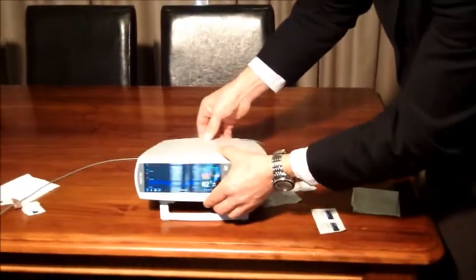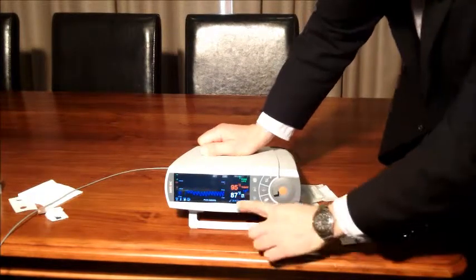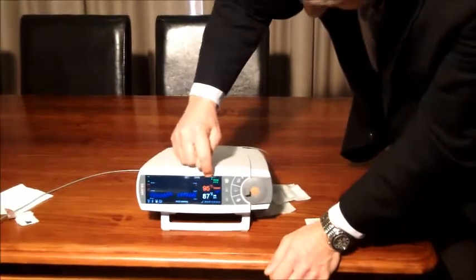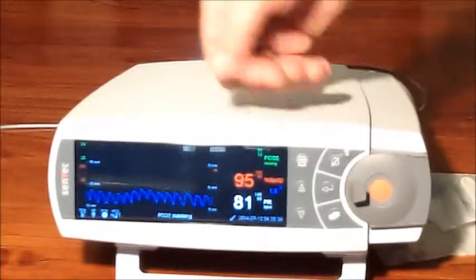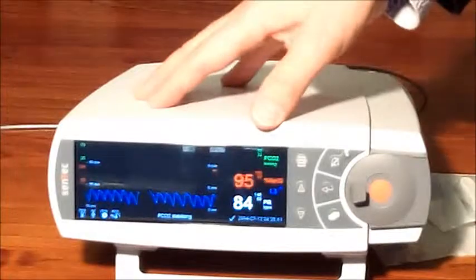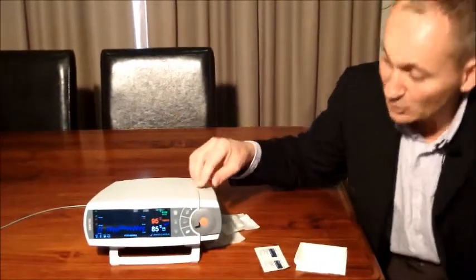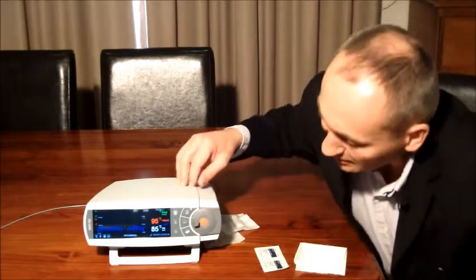Back at the screen, we've got a SpO2 signal straight away and a pulse rate signal straight away. There's a grey number rising - 18.5, 19.4, 19.9, 20 - and going up. That's the CO2 signal stabilizing on his skin. The concentrations are stabilizing and it's looking for a mathematical plateau. Once it finds that plateau, that's his CO2 reading and it's going to stay there.